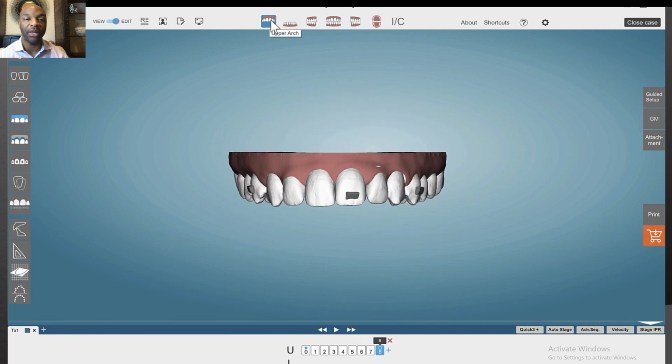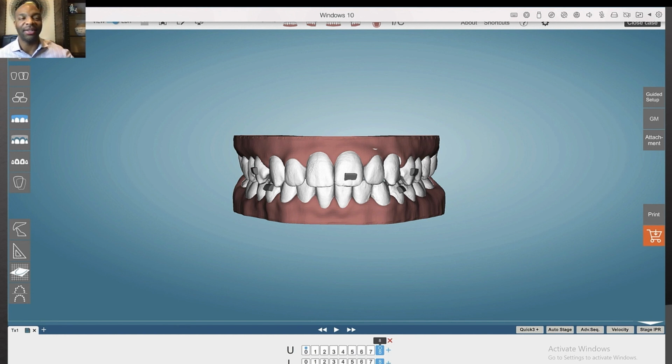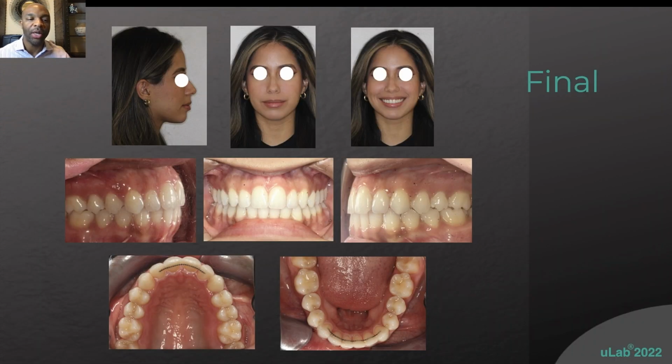Now, one thing I will say, you have to be careful when you start doing this, because you will get caught up and you'll see some things that you didn't notice on the exam. And before you know it, you have 15, 16, 20 aligners. So you have to be diligent about what your goals are and what you're trying to fix and accomplish. So this is where she finished after the aligners.